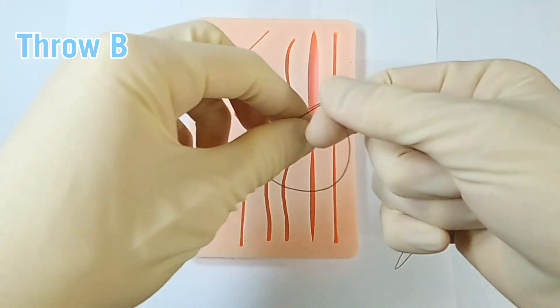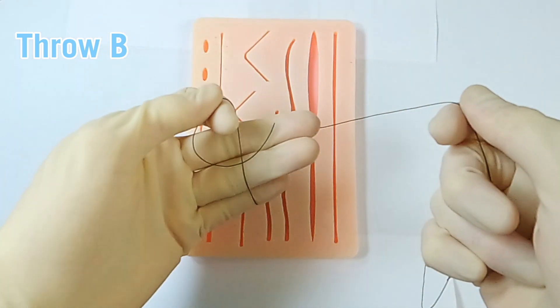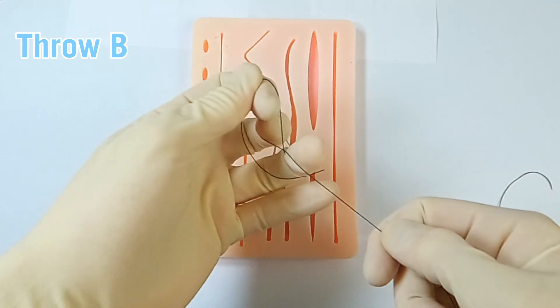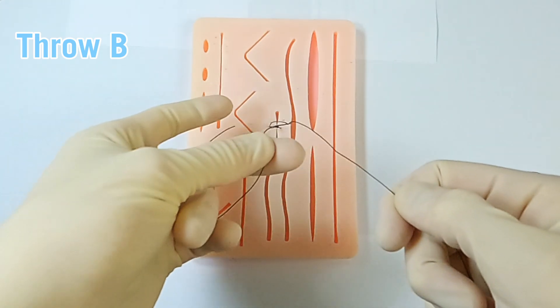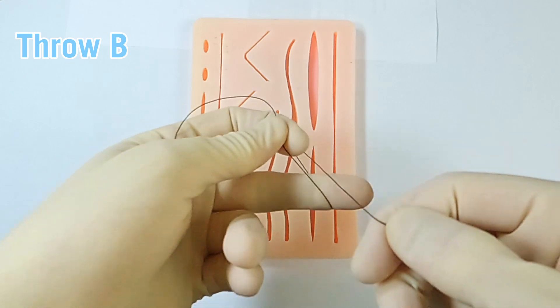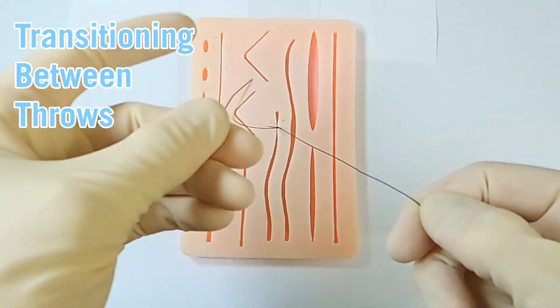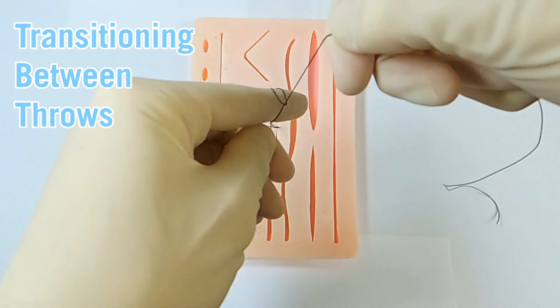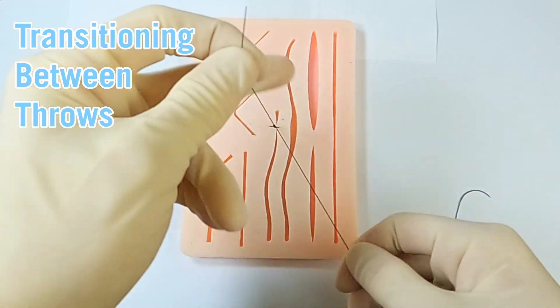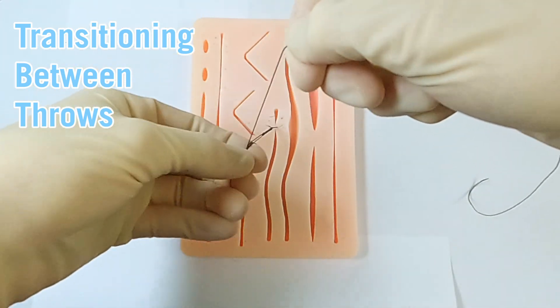For left-handed throw B, I always want to pinch between thumb and index finger, free end either pointing away or toward me. Reaching across with three, two, or one finger: post over, middle finger, flex, over, under, extend, and bring the suture through to re-pinch between thumb and middle finger ready for throw A. Here the seamless transition is shown: finishing throw A immediately ready for throw B, then set up with throw B going right into throw A to complete the knot.